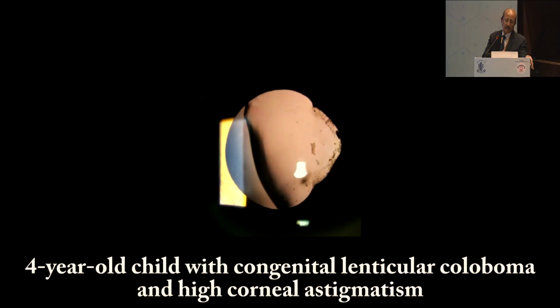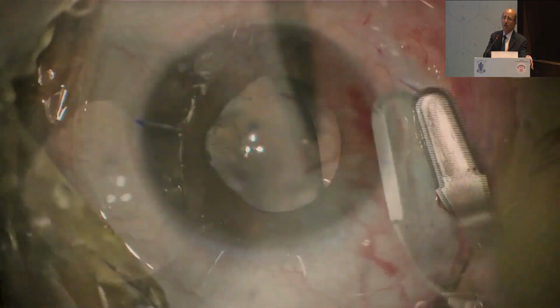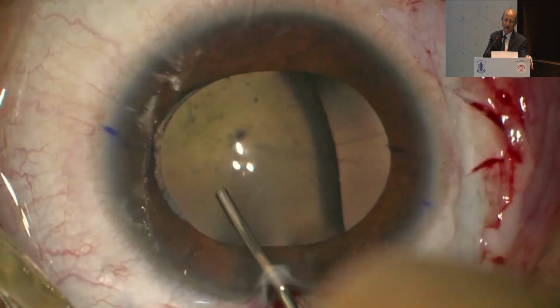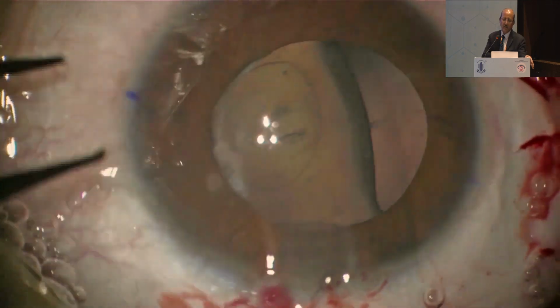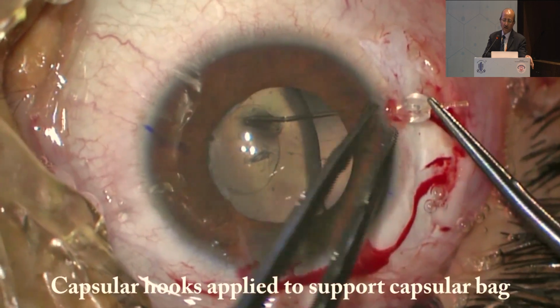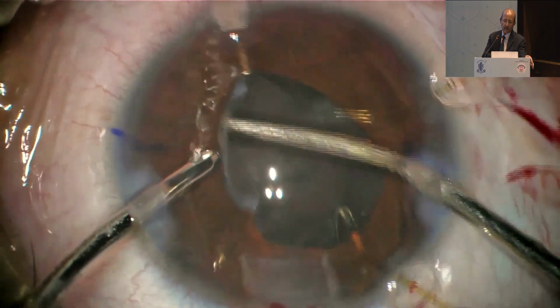Then comes this child with congenital lenticular coloboma. Here it is not a question of placing the IOL, it is a question of stability of the IOL-bag complex. What we ultimately want to achieve. So in this situation we have to place capsular hooks. These are the capsular hooks, and then the synechiae were also removed, and then removal of the cortex from the capsular bag.